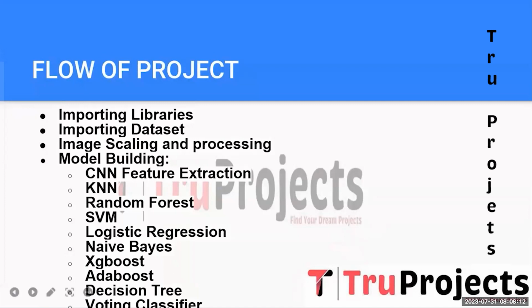And the next one is XGBoost. It stands for Extreme Gradient Boosting and is an optimized gradient boosting algorithm known for its high performance and scalability. It builds an ensemble of weak learners in a sequential manner, refining the model's accuracy through iteration. By integrating XGBoost into the project, the model aims to improve the classification performance of diabetic retinopathy by learning from the mistakes and focusing on misclassified instances.